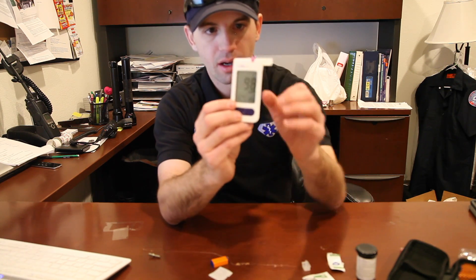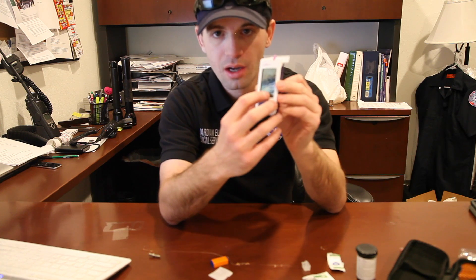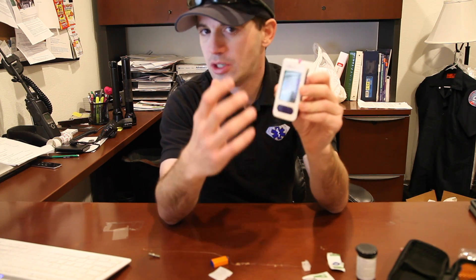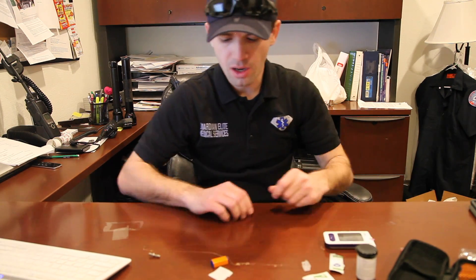The big thing with the Quintet glucometer is, first, make sure your strip goes to the side. Second, make sure that your battery is good. If you're getting any kind of error message, it could just be a simple battery error. If you do have a battery error, notify the on-duty supervisor and we'll try to get you batteries as quickly as possible. If you have any questions, notify the on-duty supervisor or give me a call.